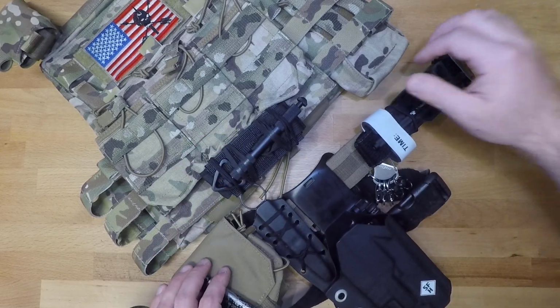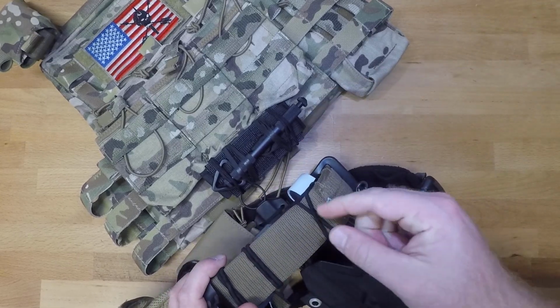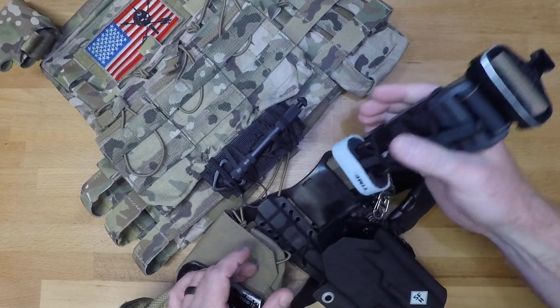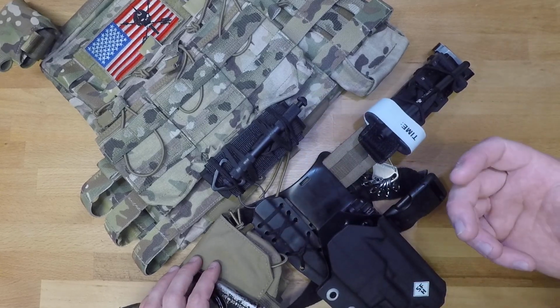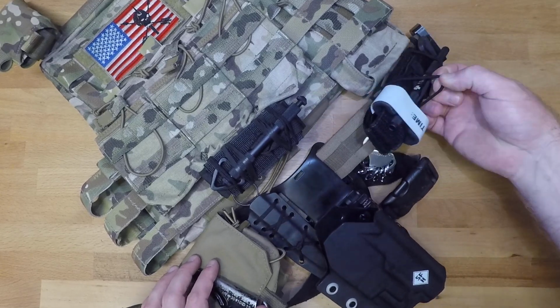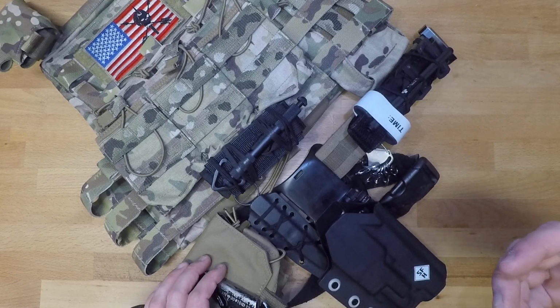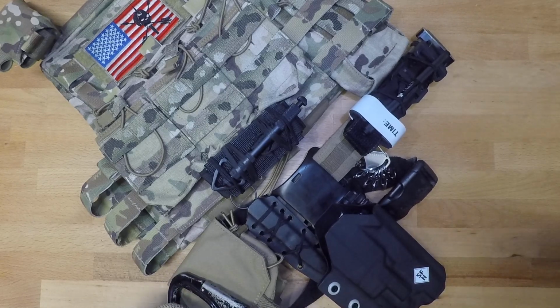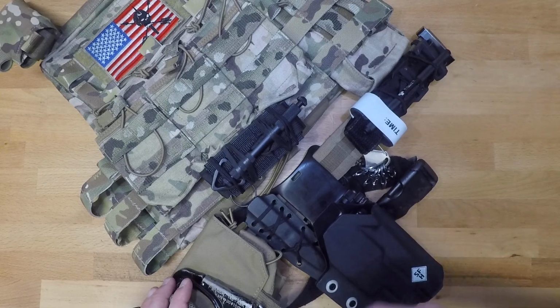When it comes to setting up the tourniquets to your belt and your plate carrier, the best way of doing it is with hair ties. You just wrap those hair ties around the belt and the plate carrier MOLLE, and then you retain the tourniquet that way with the hair tie. It's going to work a lot better than rubber bands. Rubber bands over time will just get damaged with heat, weather, and climates and temperatures and all of that. They'll snap, and then your tourniquet risks falling off.